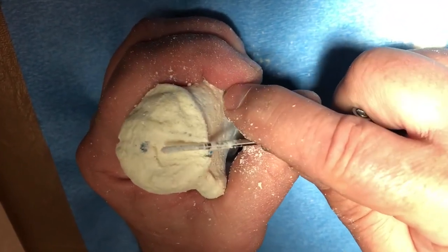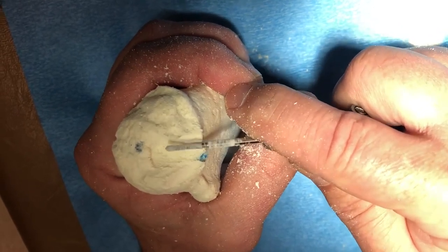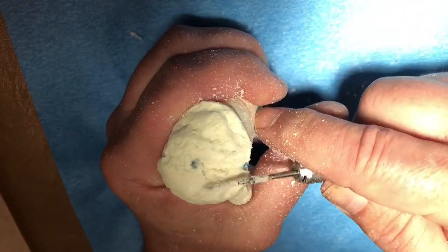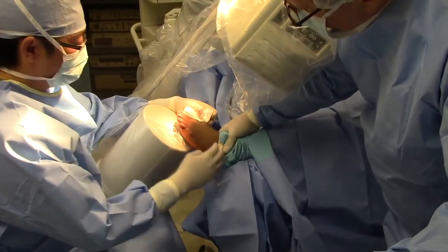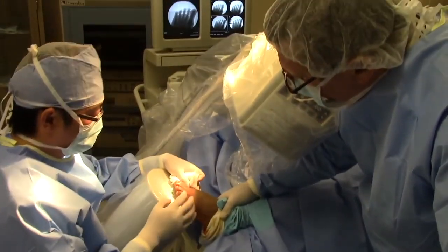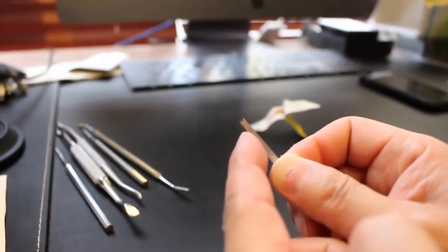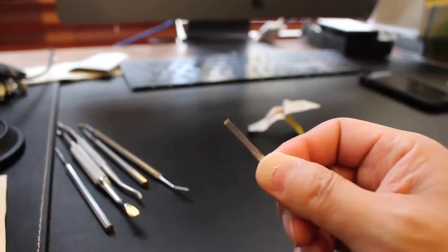This includes power drills, right? A power surgical drill set, and a mini C-arm, which will help you visualize where you're cutting, and some other instrumentation like a mini elevator, curette, and an osteotome knife, a small, micro one. We're not using a big one.